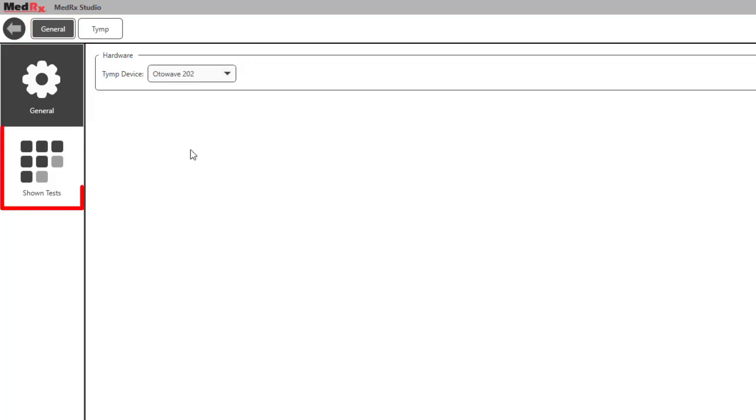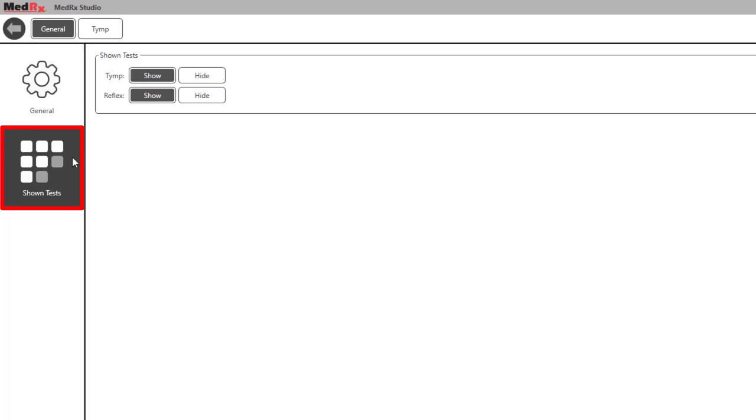Shown tests allows you to view the shown test. Options include tymp and reflex.